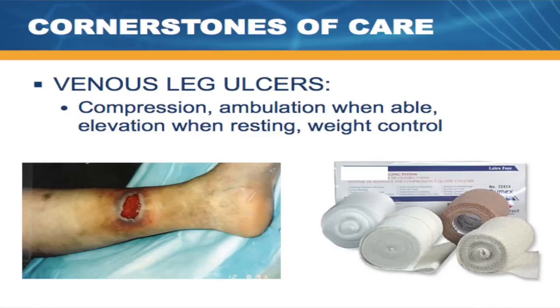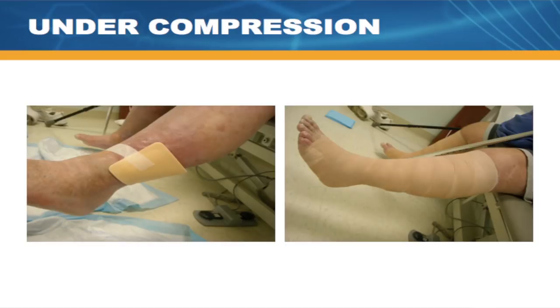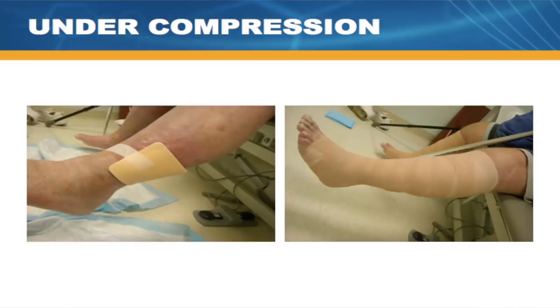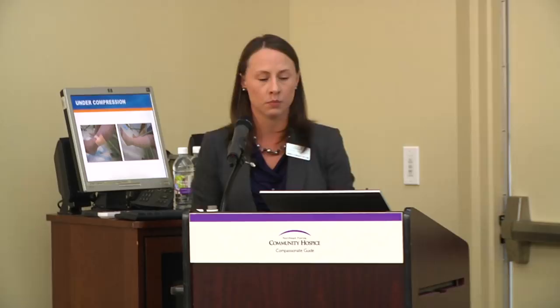So you can help to address it by using compression when appropriate, and also by doing things like having the patient ambulate, getting that calf muscle pumping, getting that fluid back up to where it belongs, when appropriate. Elevating the limbs can also work nicely for some of these areas. We need to address the whole patient and not always just topically what you're putting onto that wound. Underneath compression though, we do need to have a dressing. You still need to put something on that wound. So some nice options are some of our more modern wound care dressings because you're not going to want to be changing it every couple hours. It needs to be something that's going to hold up. So this is again just an example of a foam dressing, in this case taped in place on this swollen limb prior to a multi-layer compression bandaging being placed.